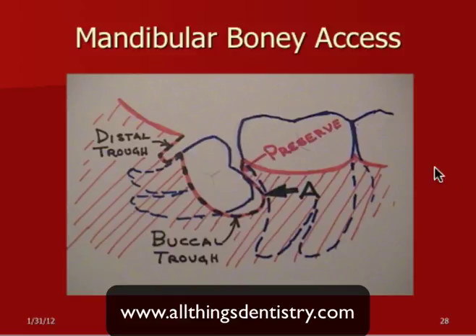Just before we go on, sir, I know that as general dentists in our office, we typically have the impact air, the angled piece. I know here we're using straight pieces. Before we start talking about more specific access, what are your thoughts on either use and the burrs you've been using? A little bit of it's a personal thing.